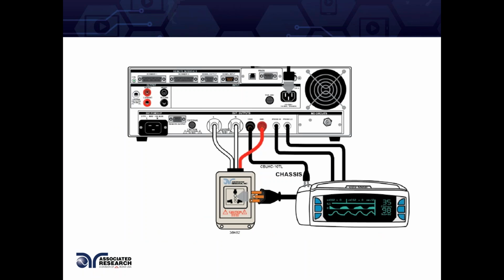So as I mentioned earlier, the network itself is inside our product. This is a resistor capacitor network within our product. Now, to run a leakage current test, you have to be able to power up the device under test, also known as DUT. The DUT needs to be powered up at 110% of the normal input voltage that is listed on the label. So if you make products that are listing anywhere from 100 to 230 or 240 volts, you need to be able to test this product at 240 volts plus 10% more voltage to consider an overvoltage condition. This puts you at a testing voltage of 264.